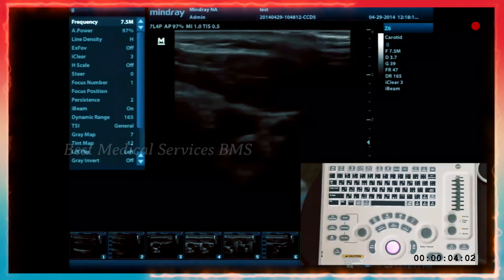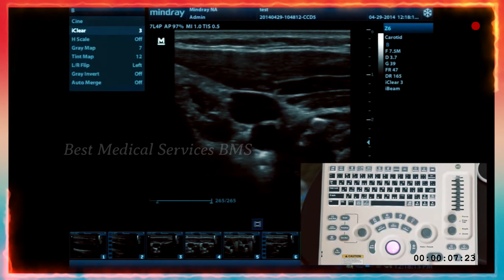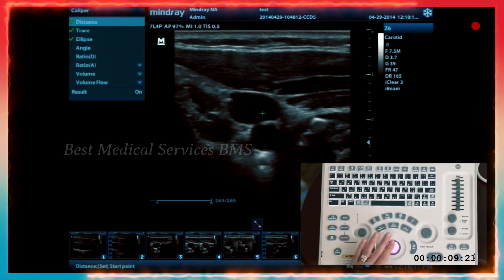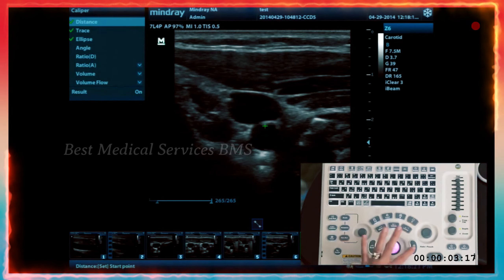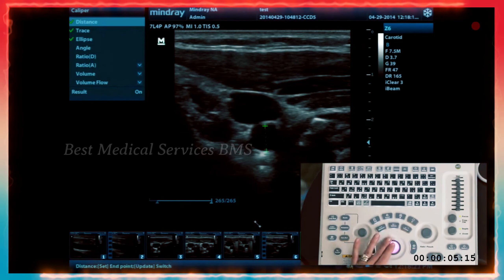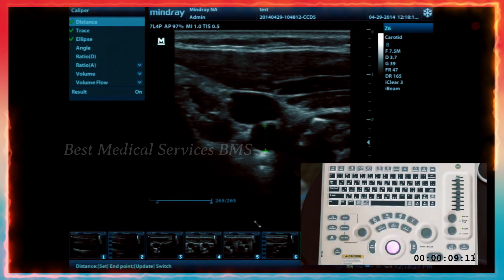If you're scanning in these modes and want to measure vessel diameter, hit freeze and caliper. That'll give you B-mode measurement calipers. You'll have options for distance, trace, and ellipse. Using the trackball and set key, you go between those things. Set and update to go between the caliper points.